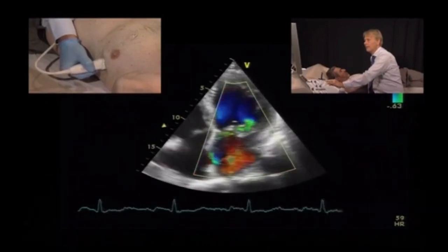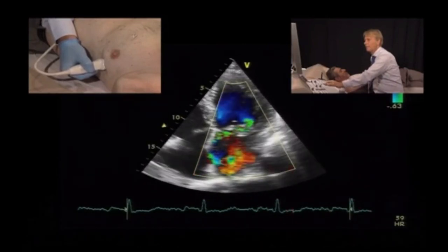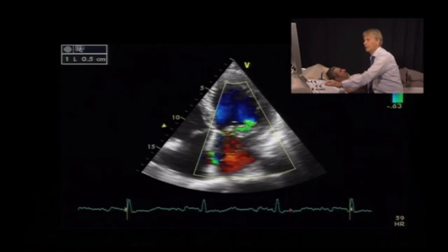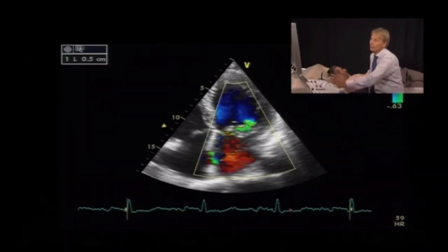In this case, we can see that the vena contracta is probably, if we measure it, 0.4 or 0.5 centimeters. So this would correspond to a moderate to severe mitral regurgitation.